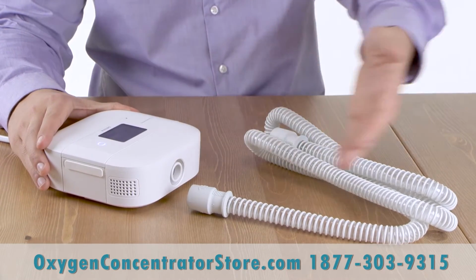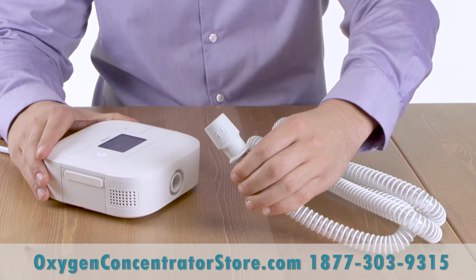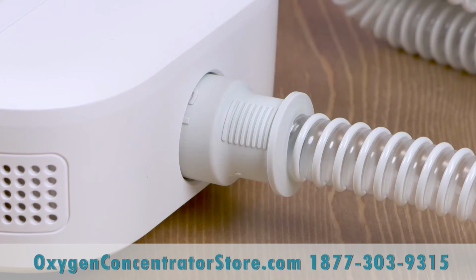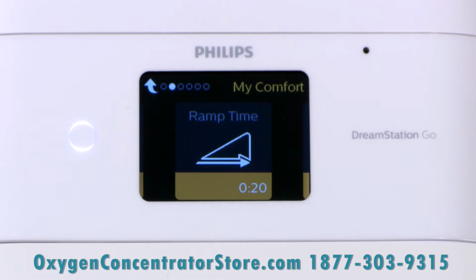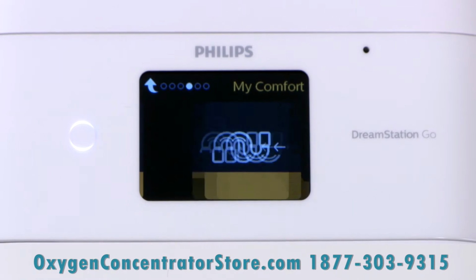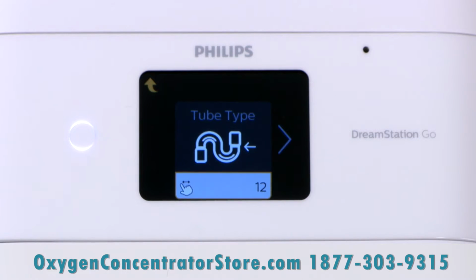In addition to the 12mm micro-flexible tubing, the DreamStation Go supports the use of larger 15mm and 22mm tubing. If using a 15mm or 22mm tube, make sure to change the tubing type to the correct setting in the My Comfort section of the DreamStation Go menu.